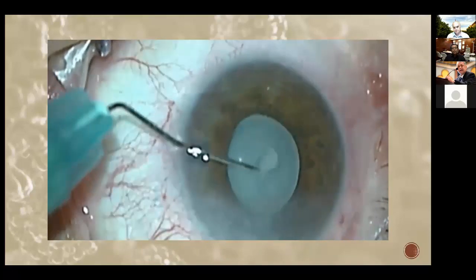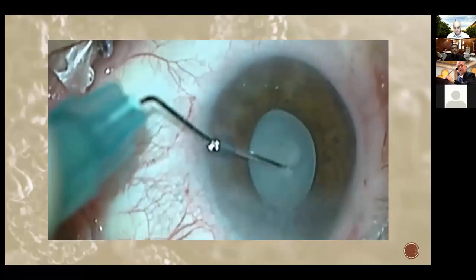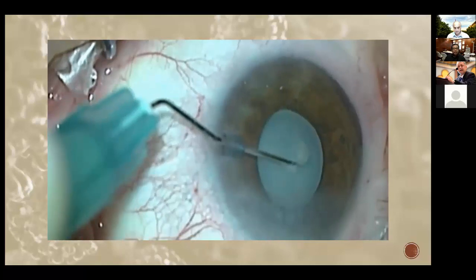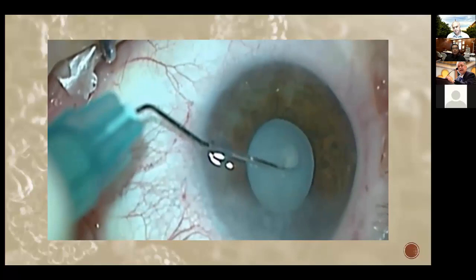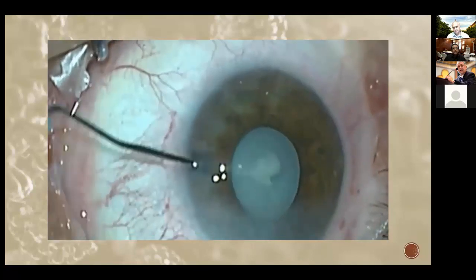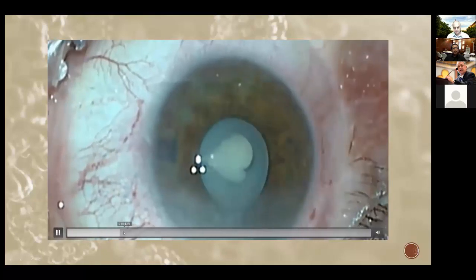Make sure to reduce the pressure inside the capsule. Aspirate more. And as I aspirate, I discovered that this is going to be fully aspirated. And now I'll try to aspirate with a cannula.